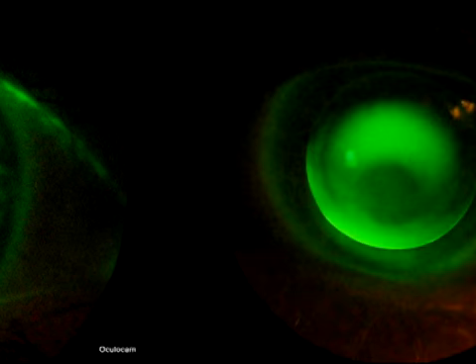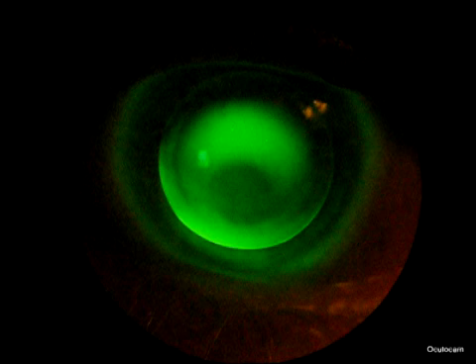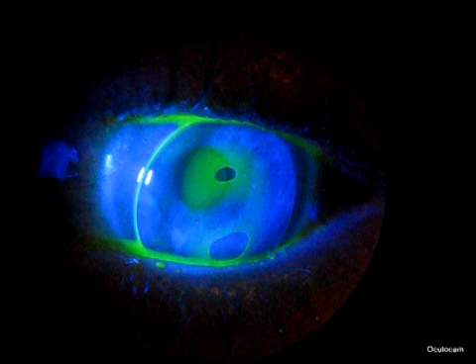For the past year, I've had the opportunity to work with the OculoCAM system. This section will be directed to specific examples within a typical practice setting. All of the following images were acquired during normal clinic hours and demonstrate applications of the OculoCAM system obtained during the hustle and bustle of a busy clinic schedule.